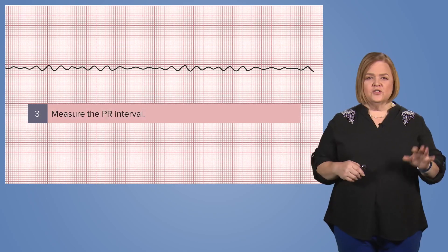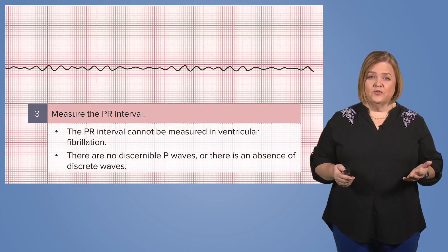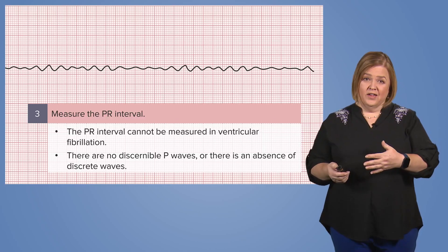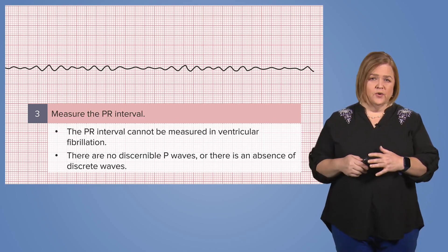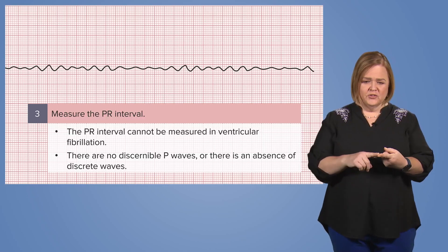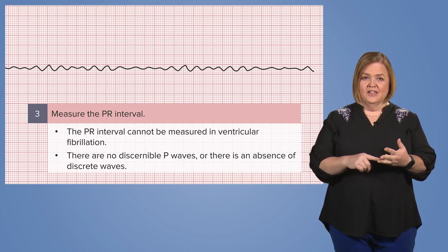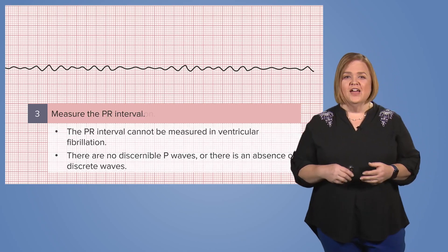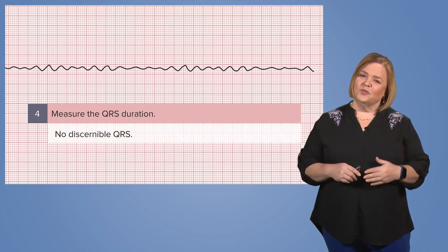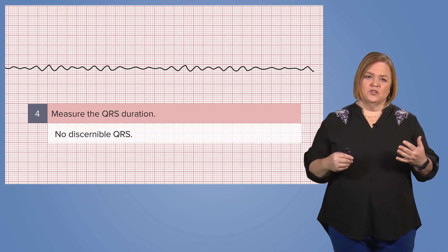Now measuring the PR interval — if we don't have a P wave, we can't measure a PR interval, so that's out. So far, could we do step one? No. Step two? No. Step three? We're 0 for 3 right now. Let's look at step 4. We've got another winner — you can't measure the QRS.